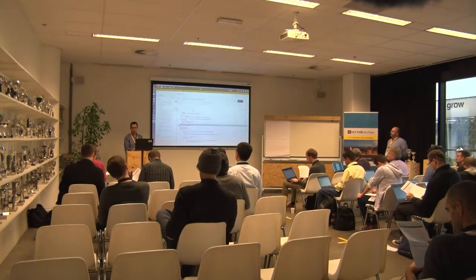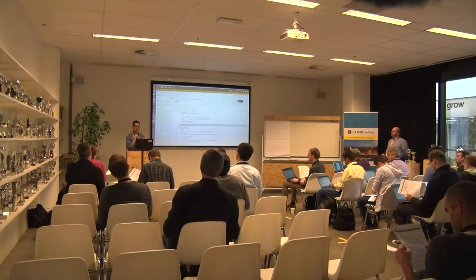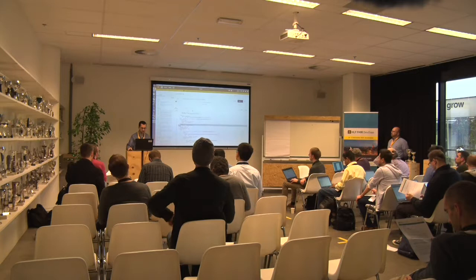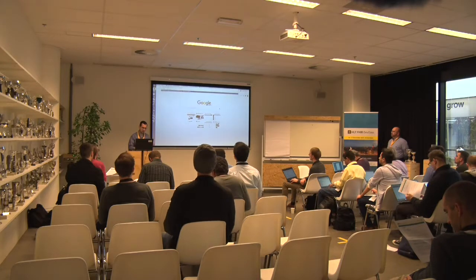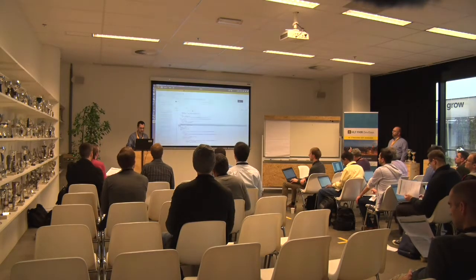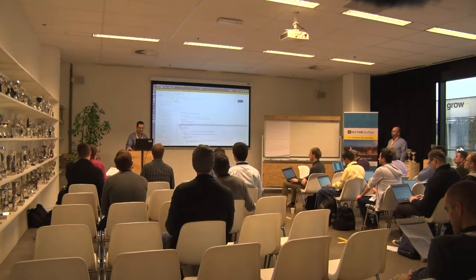I can tell you another thing I've also seen is a lot of servers don't actually let you specify the ID as much as they will just generate one for you. And they'll usually use the UID generator, the one that looks like, here, I'll bring up one example. Oh, the Microsoft one, that's a common implementation I've seen. So here's an example of what it would look like. A lot of the servers I've seen do that, but some enforce it, some don't. I don't know how detailed the standard is in that area. My experience is a lot more practical than theoretical.